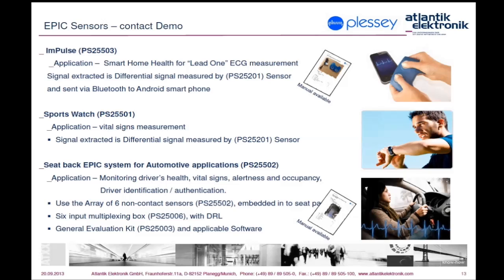There are several demos provided by Plessy for demonstration of EPIC sensors. Here are three of them presented. The first two are showing the use of contact EPIC sensors. The Impulse measures lead one of the ECG signal between two limbs — in this case, two fingers.